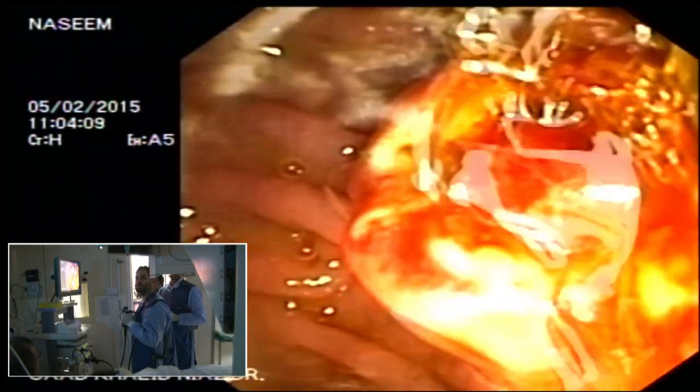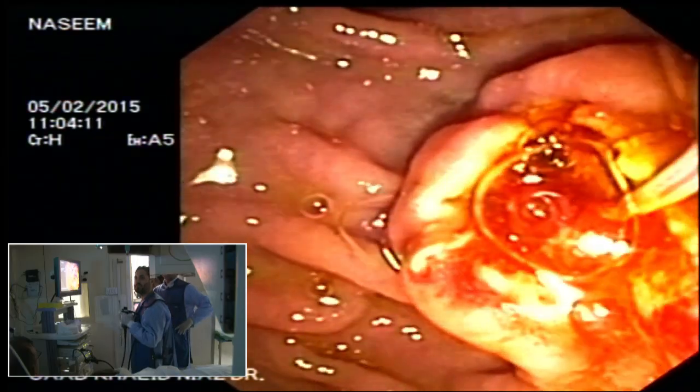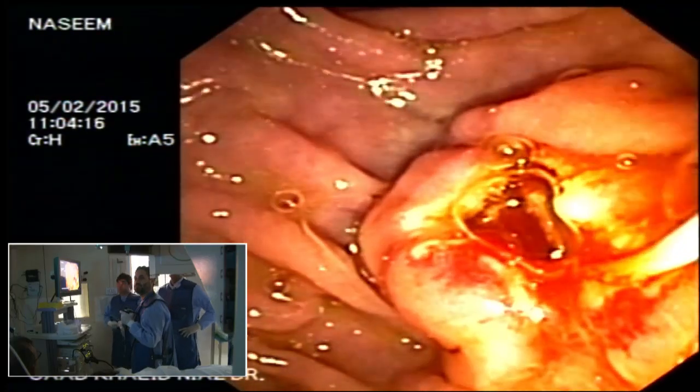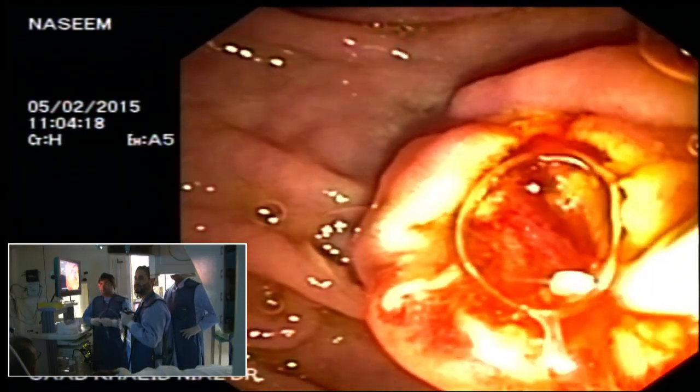फिर release the bridge. If you start bleeding and you stop cutting, if you start bleeding, you don't have to stop cutting. Just because if you were cutting in and start bleeding, then you अच्छा okay ठीक है.